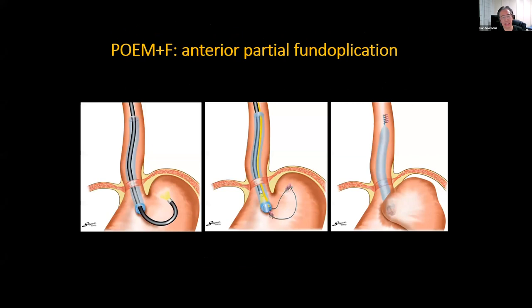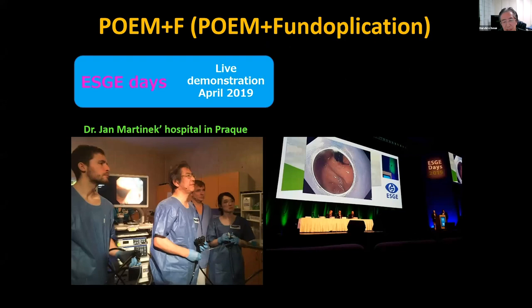The procedure is like this. This is a live demo from last year at ESG days in Prague, at Dr. Jan Malknek's hospital. You can see this is a Dor-like fundoplication.